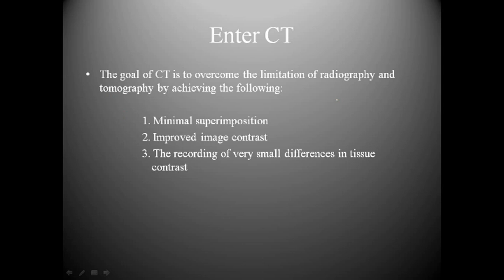So that brings us to CT. A lot of times it gets discounted, but the overall goal of CT is to overcome the limitation of radiography and tomography by achieving the following. You want to star these. You will see these on an exam. Number one, minimal superimposition. We don't have a lot of overlap because we see things in a different way. We see everything, not just one little specific part.